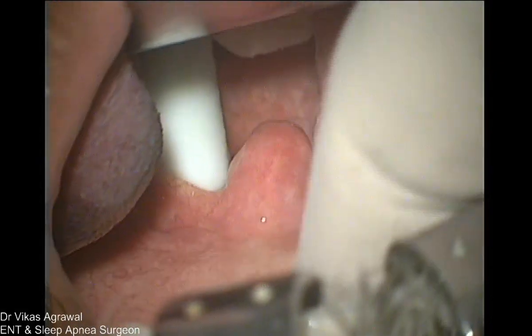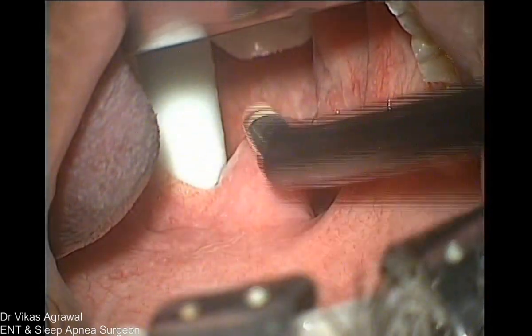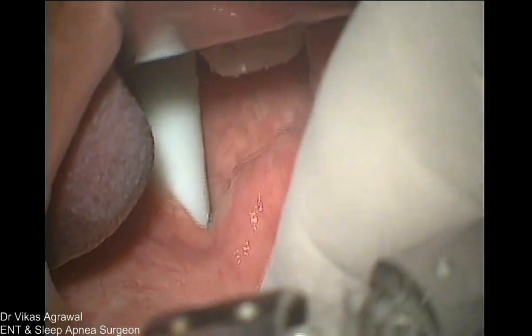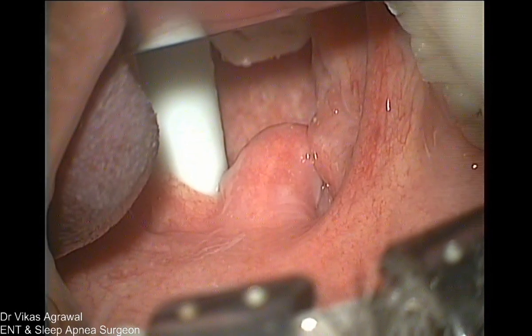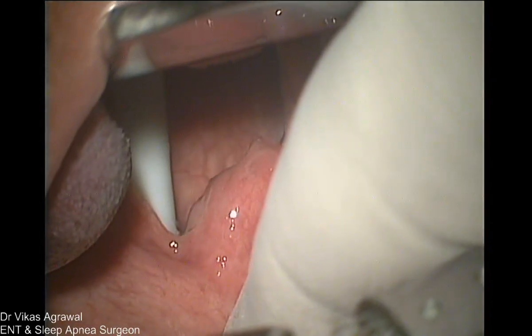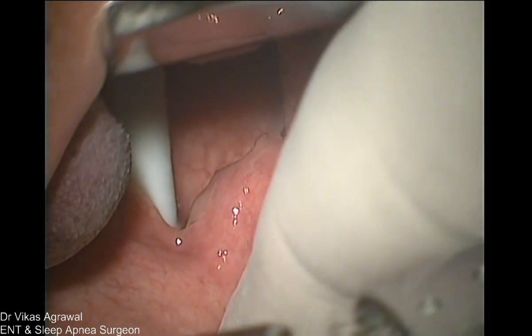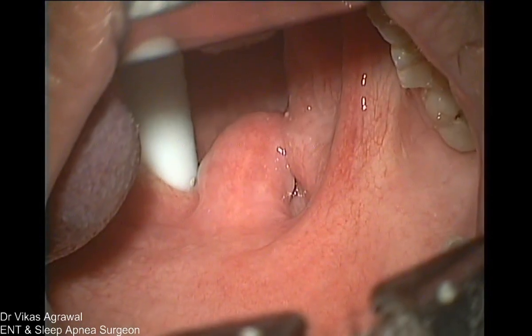So we'll do the palatal surgery first. Again, as we decided last time, that anterior pillar to anterior pillar is a good landmark. Now since here the nasal tube is in place, we'll not be able to see exactly where the posterior pharyngeal wall is going to come, but I'll try to put my finger down. Can you see that? It's touching here. Is it visible? So now this is still again just above the line joining anterior pillar to anterior pillar.